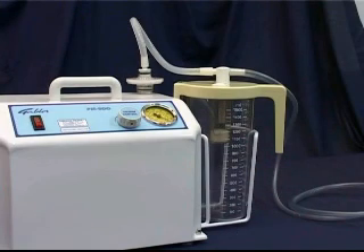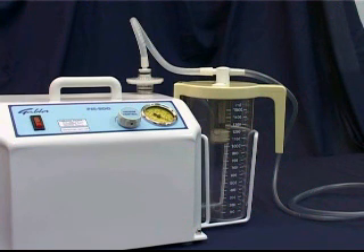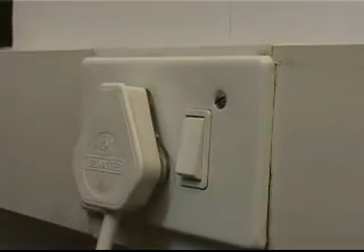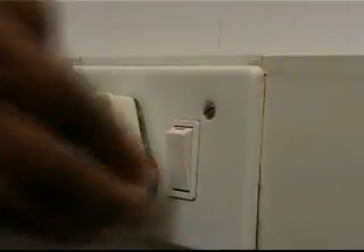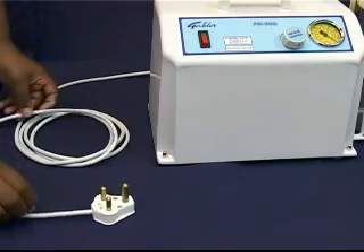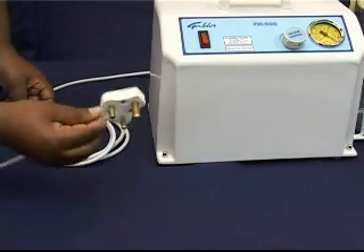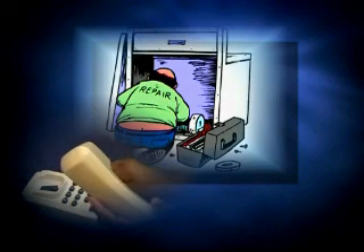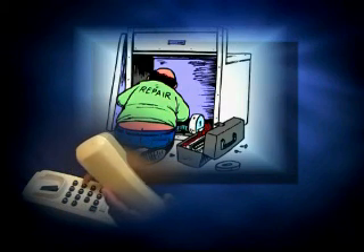If the unit will not start after being switched on, carry out the following steps. Check the electrical supply to the wall socket, then switch on the wall socket. If this does not solve the problem, then check the lead and plug top for damage. If the problem persists, report the fault so that a qualified technician can be contacted.